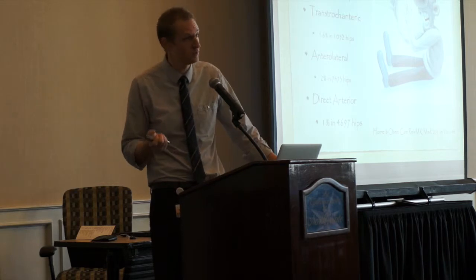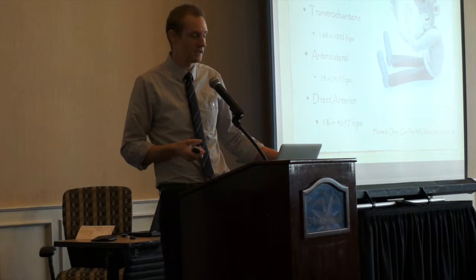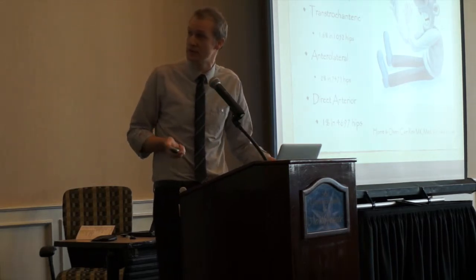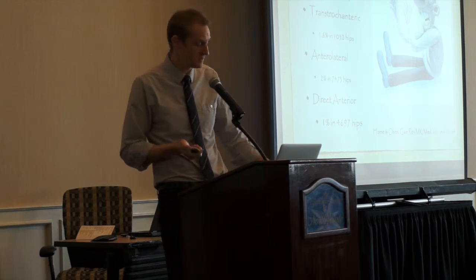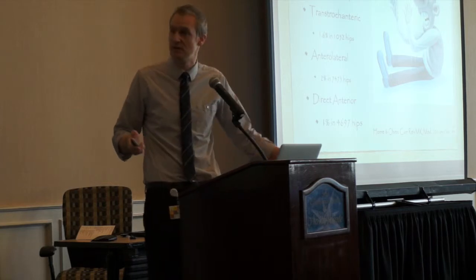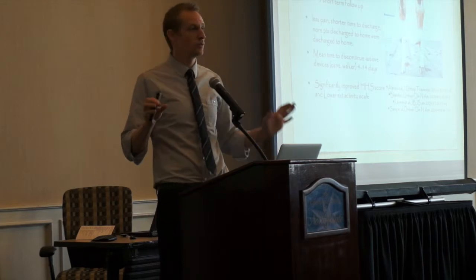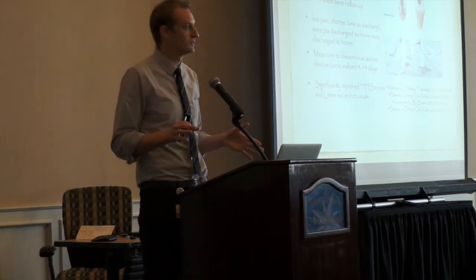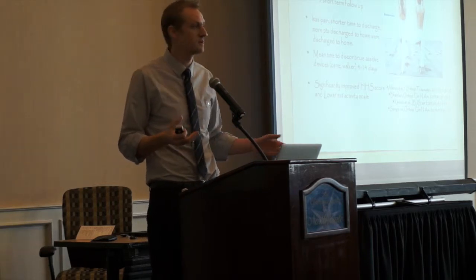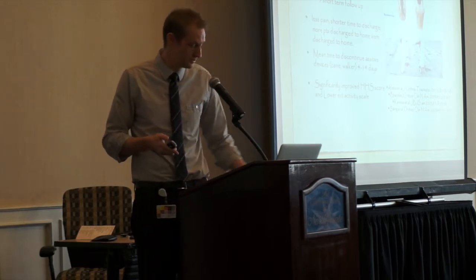However, their dislocation rate wasn't bad with that approach, about 1.6%. Obviously, that introduces other complications with that approach that we don't have to go into. Anterolateral approach is around 2%. Again, high number of hips, 7,500. And the direct anterior approach, around 5,000 hips in the literature, have a consistent dislocation rate of around 1%. So we're not eliminating dislocation, but it certainly is drastically decreasing dislocation rates, especially compared to what's most commonly being used in the United States, which is the posterior approach.